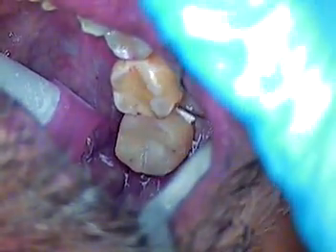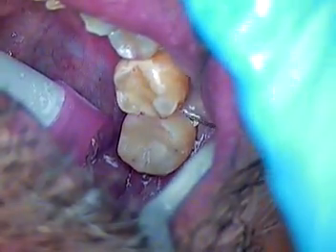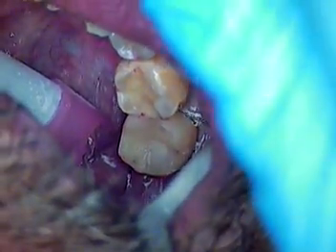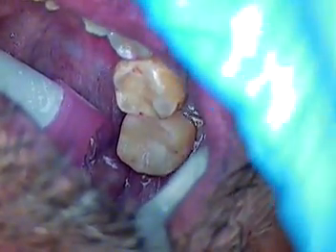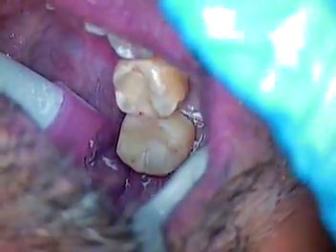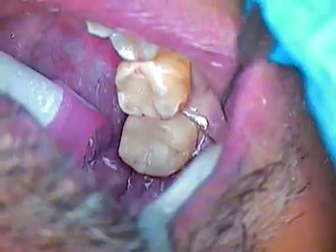Tempon I don't think has its place in posterior. I think in the anterior region Tempon works pretty well, but for back teeth, unless you have very long preps, nothing better than Enduralon. It's been around for years — I have it in my textbooks from when I was in dental school, and it's just a super material.